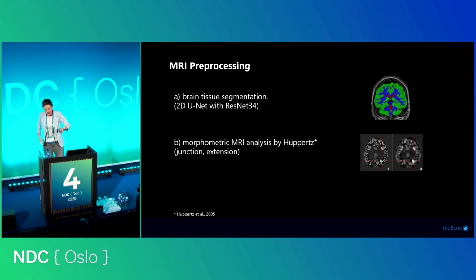And the other one, quite interesting, is that it turns out that when you apply additional blurring to something that was slightly blurred at the beginning, it will expose this feature even more. I was lately at one of the cybersecurity talks and also learned that this is a very similar technique to what you can use to see which of the pictures, and where, have been changed in Photoshop or whatever. So it's quite interesting that it's just via applying additional blur.